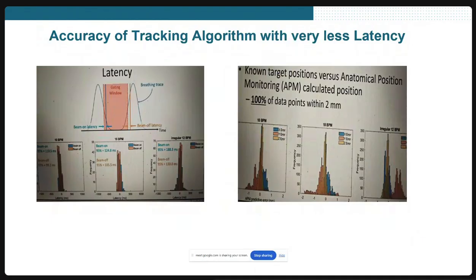The advantage is that the system has AI capability: before we treat the patient, the system takes 1 minute of reading the patient images and respiration pattern, and understands the way the patient breathes and the tumor moves. Then accordingly it counters the motion artifacts, predicts where the tumor can come, and does the delivery. That is really useful for getting the latency so low.